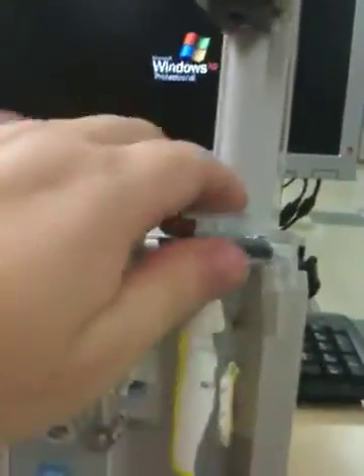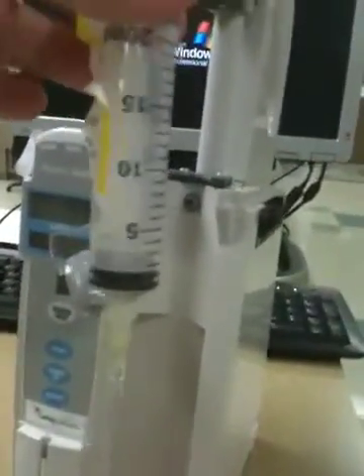When you get that set, you prime it just like you would anything else. This piece is actually out and up like this and this is unattached like that. Your syringe will come from pharmacy and you'll scan it, you'll have the meds in it, and you'll have the pump prime.